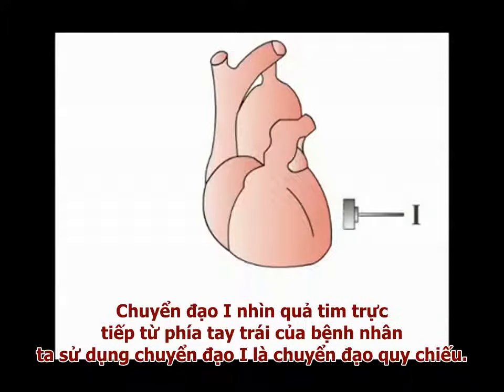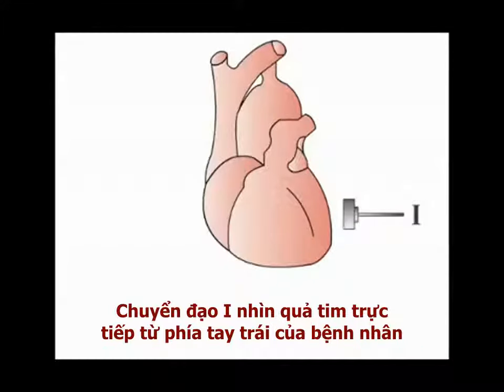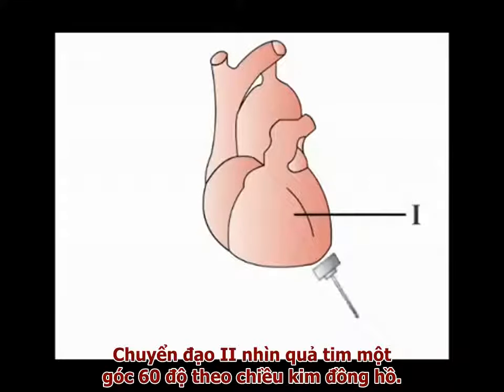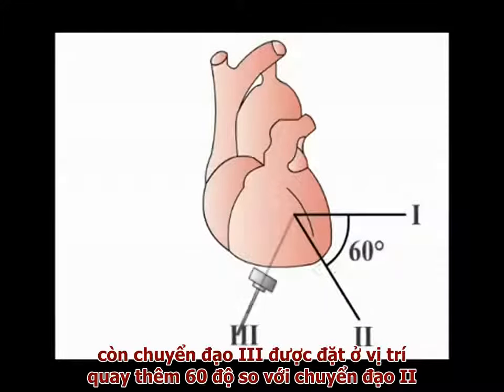Lead 1 looks directly at the heart from the patient's left-hand side and defines 0 degrees in all further discussions of the frontal leads. Lead 2 looks at the heart at an angle 60 degrees further clockwise, while lead 3 is positioned a further 60 degrees clockwise from lead 2.